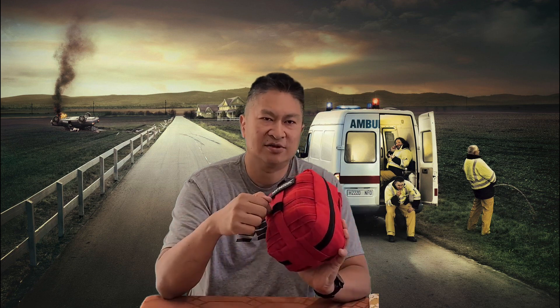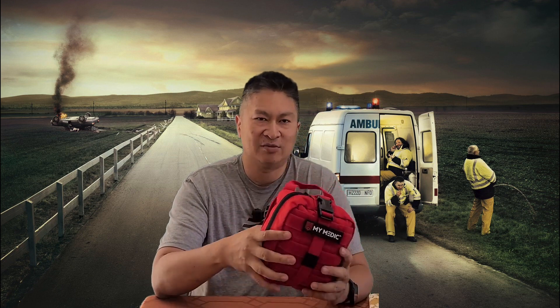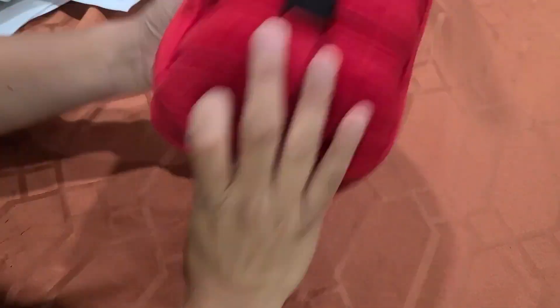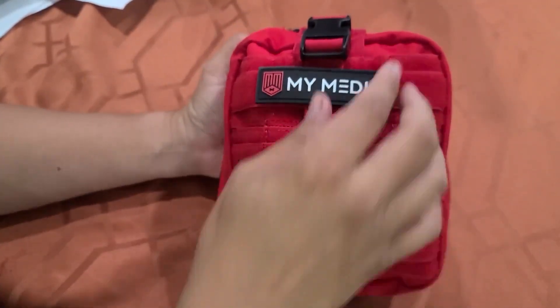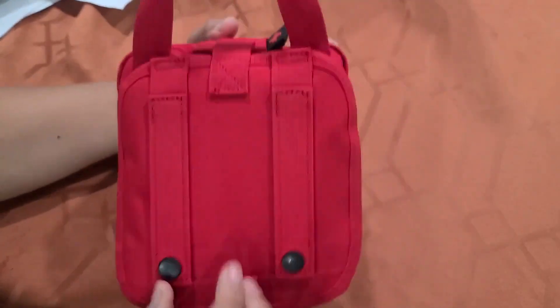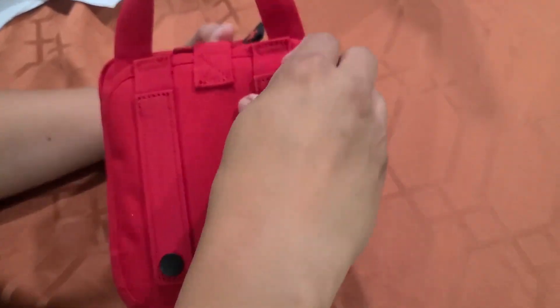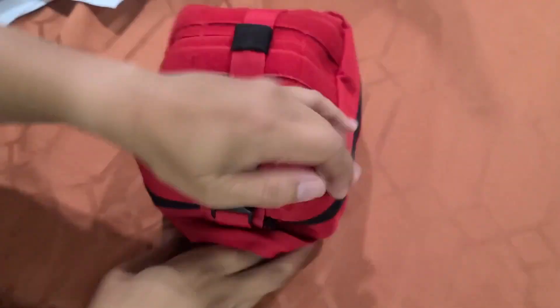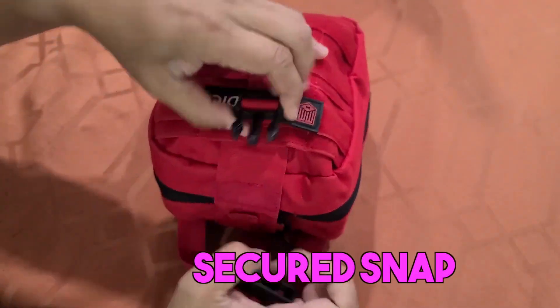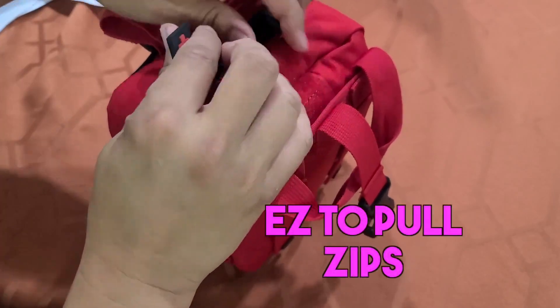I'm going to show you the contents and what you get. It's a little bit harder to put things back once you take them out. All right, let's get this opened up. It's really secured the way it is and I really like that — nothing's going to spill out. I also like these straps in the back. They work with MOLLE panels or I could attach it to a belt or something else. It's very easy to grip and unzip.